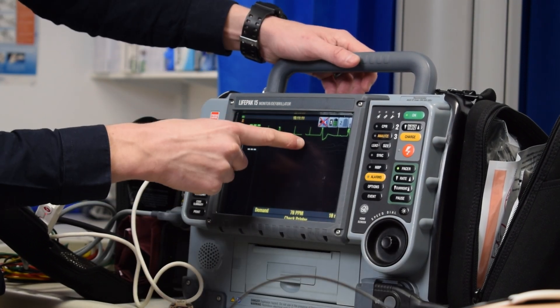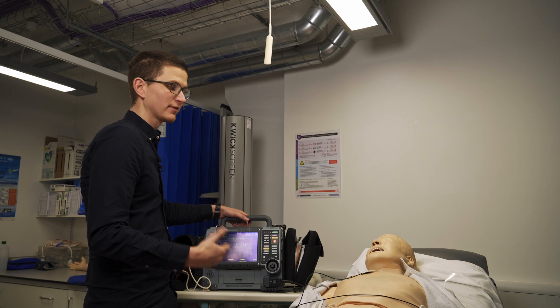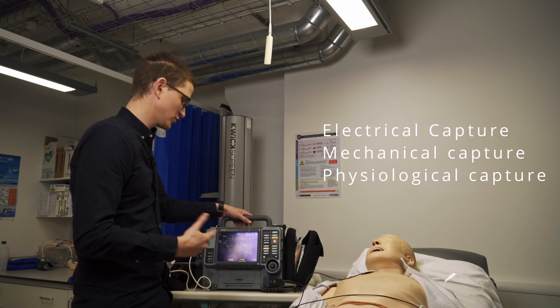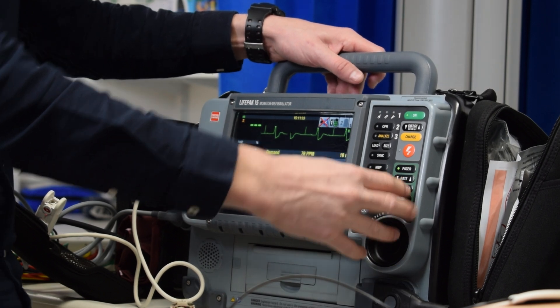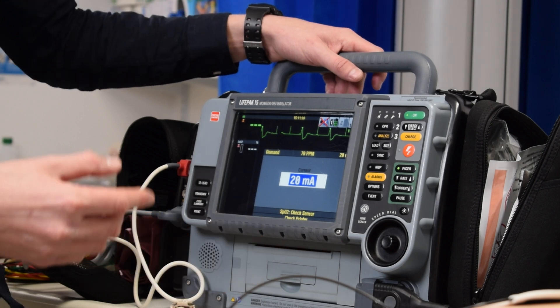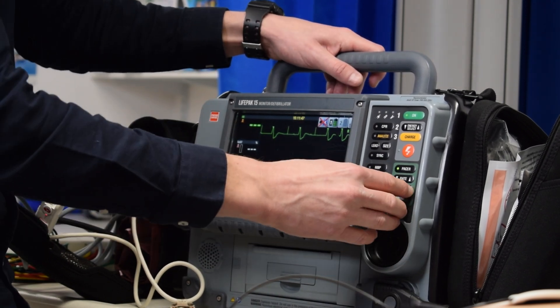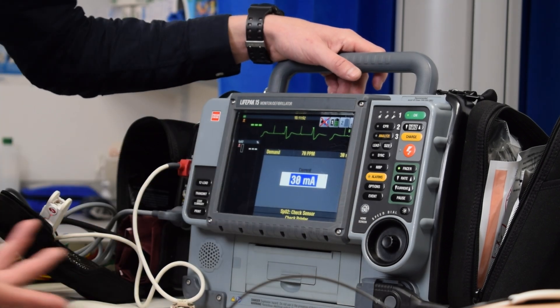We see our pacing spikes, but after each pacing spike we don't see any QRS — and that's what we need to confirm capture. Some machines require you to push select after each milliamp increase to confirm the setting, while others like the LifePak just increase as you turn the dial continuously.